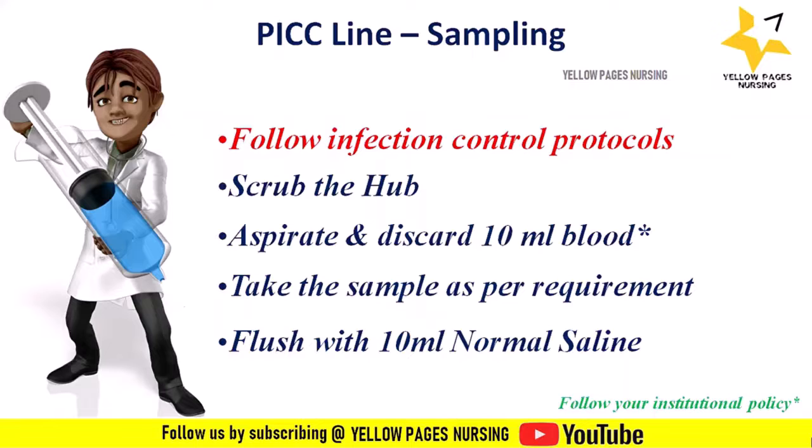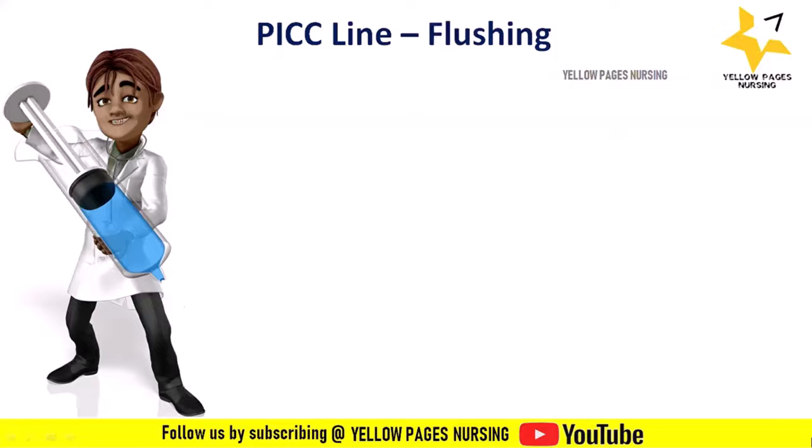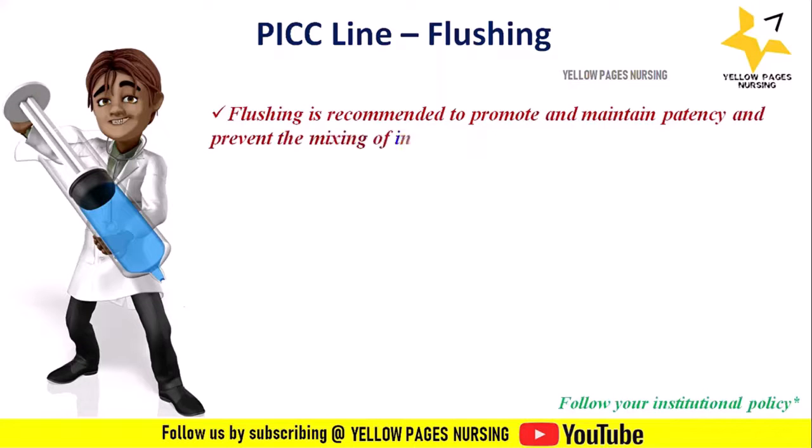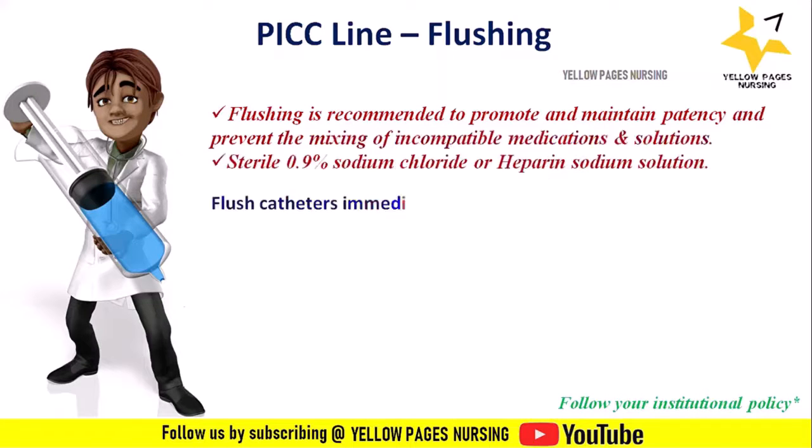Next, flushing of the PICC line. Flushing is recommended to promote and maintain patency and prevent the mixing of incompatible medications and solutions. Sterile 0.9% sodium chloride for injection should be used by a clinician to flush a catheter unless the manufacturer recommends flushing with heparin sodium solution.